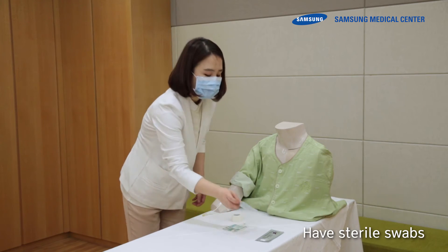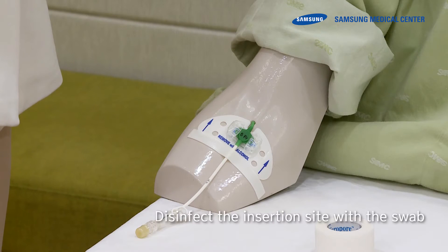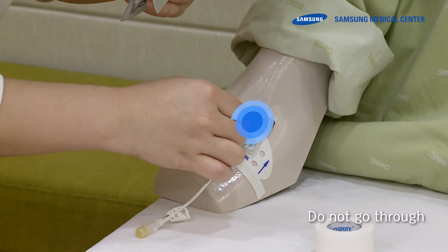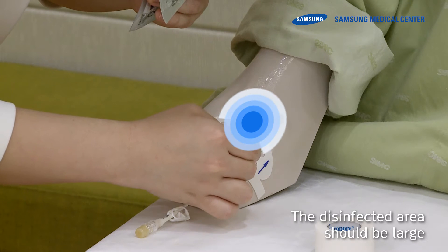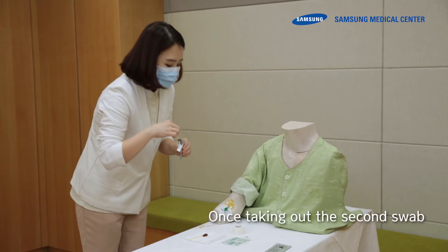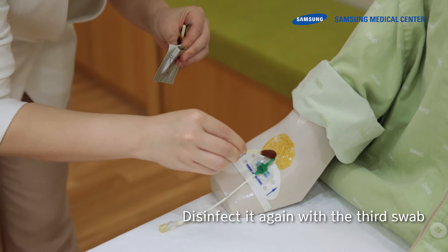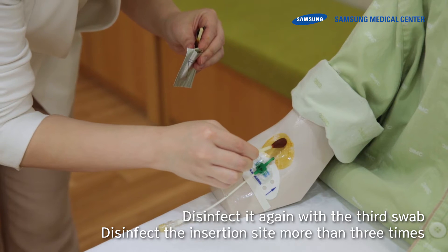Have sterile swabs ready and take the first swab out. Disinfect the insertion site with the swab by making concentric circles in an outward direction. Do not go through the disinfected site again. The disinfected area should be large enough to be able to apply the Tegaderm. Take out the second swab and disinfect using the same method. Disinfect again with the third swab. Disinfect the insertion site more than three times.